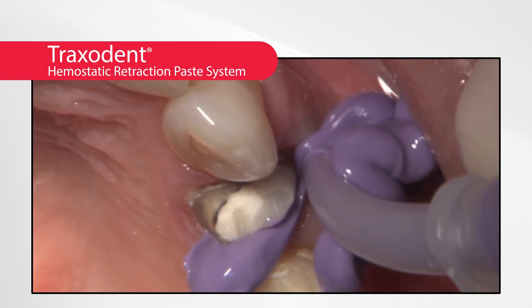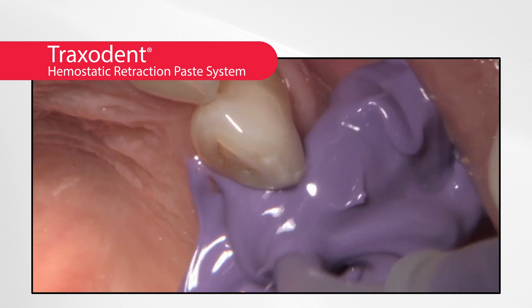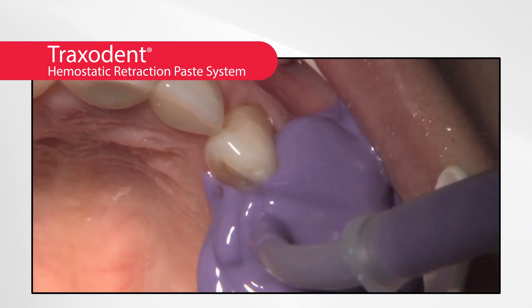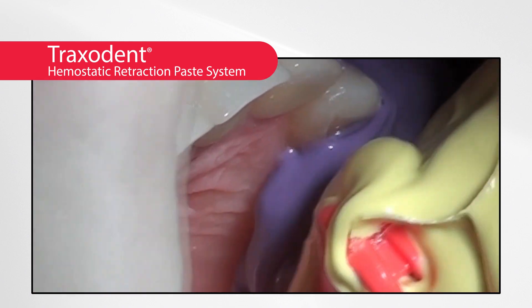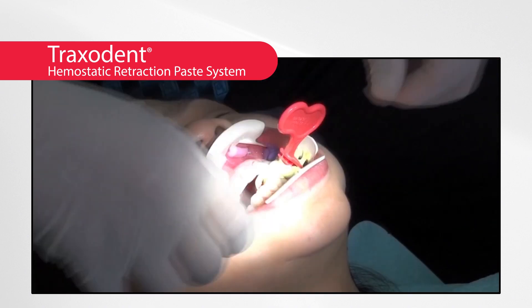In this case, a polyether impression material is placed around the prepared tooth, thoroughly covering the entire area. Heavy body impression material in a T-lock triple tray is seated and as the patient closes into normal occlusion, the comfort view retractor is removed.